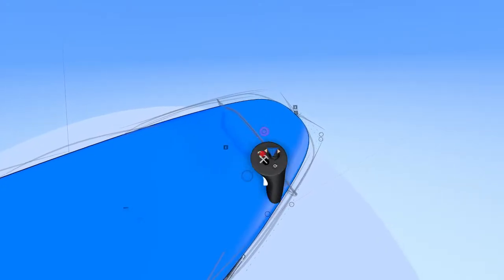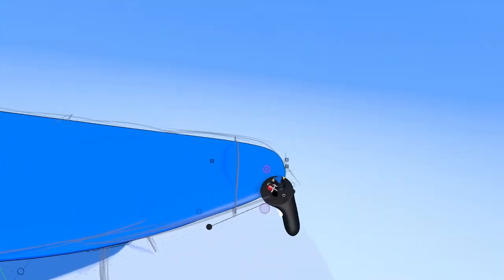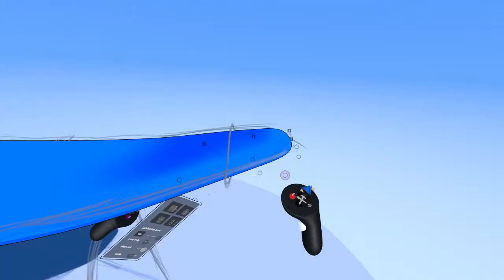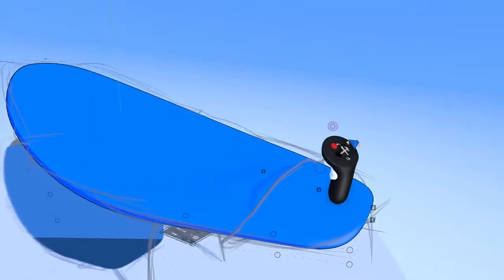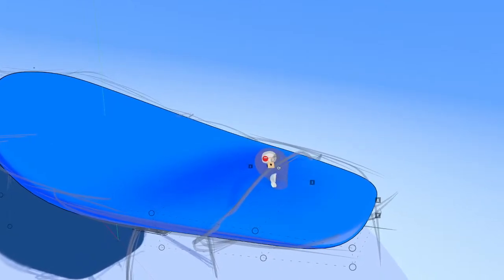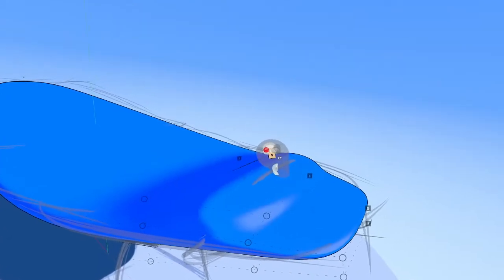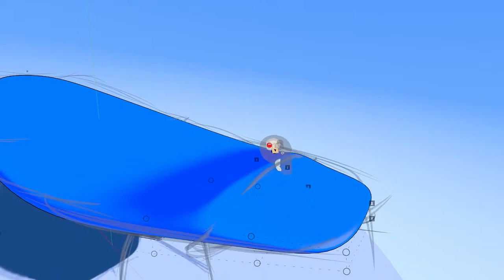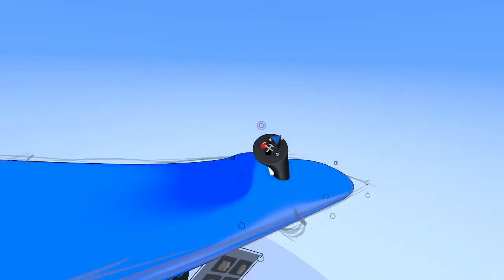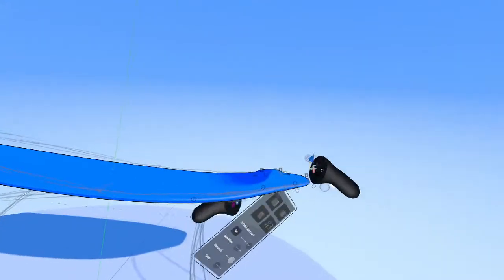And now what we can do is actually start to shift things around and add more detail. So if you want to click in a new row of edge loops, you just point somewhere along an edge, press the pointer finger trigger, and you can drop in a whole new loop. If you want to duplicate a face up, you can grab the face, press the pointer finger trigger, and then you can scale it by going left and right on your joystick. So we have this kind of raised section here for the patient's neck, and I think that option works well there. We can duplicate a surface up and have this risen section.